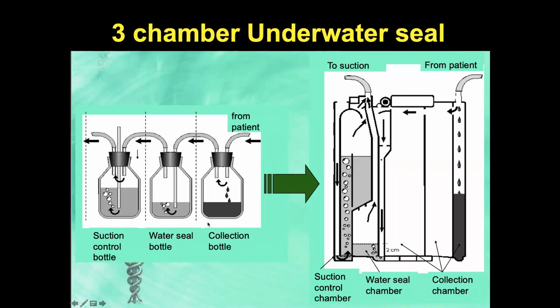So you have a suction. This is the new thing that you see. There are 3 chambers in this, as opposed to the single bottle. There's one from the patient where the fluid is coming, one where air is coming in here, and one for venting the suction. More importantly, there is room air venting. Can you see this room air going in here? This controls the suction.